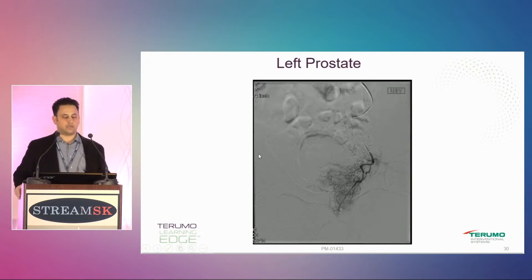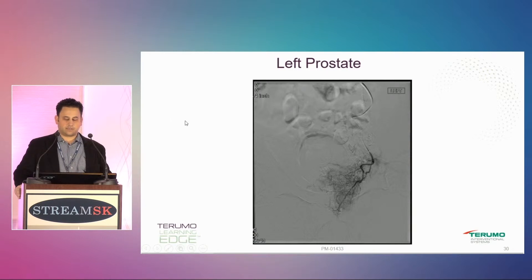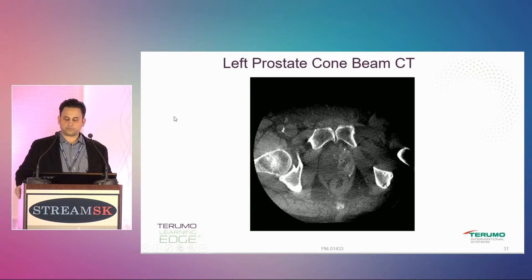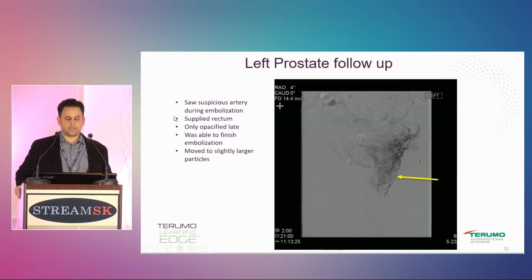Here I got into the left prostate artery — looks pretty good. Here's a cone beam CT showing that I'm opacifying the left side of the prostate and the central gland.